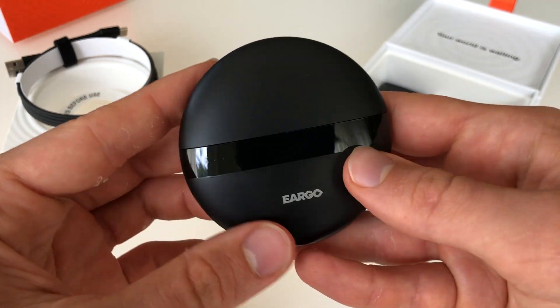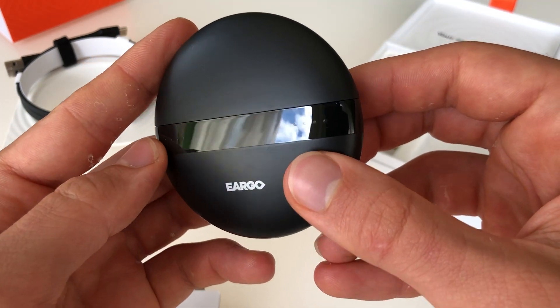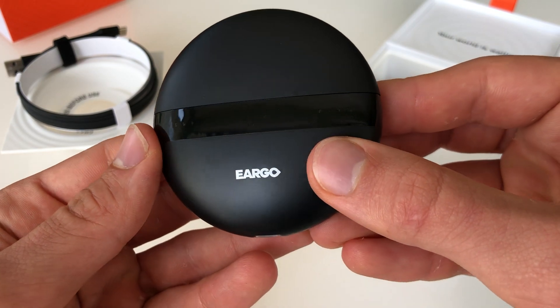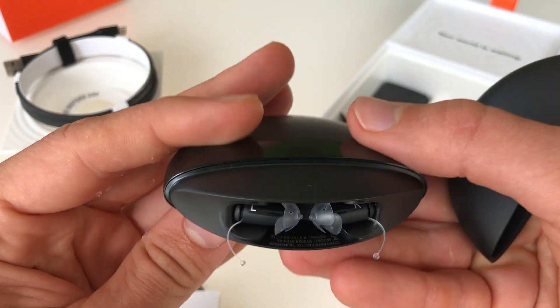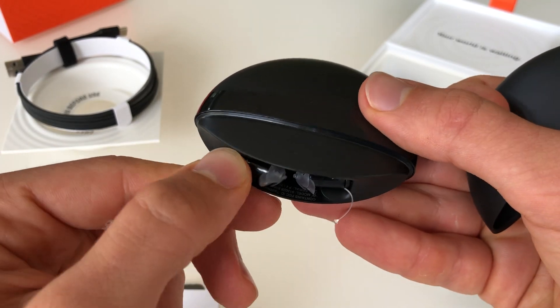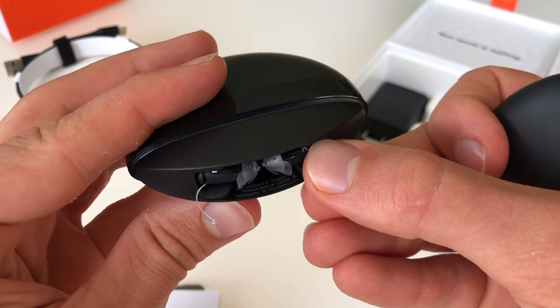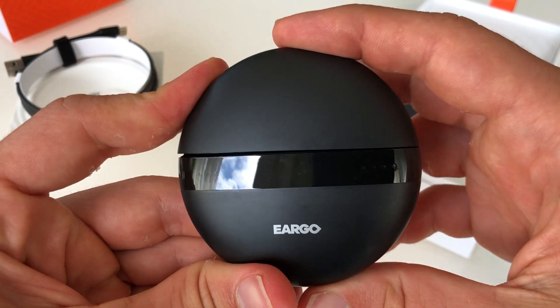Closing the case like that. You can see here there's an electrical line — this has some design on it — and that will show the charging strength of each hearing aid for the left and the right. Up and behind the hearing aid, you can see there's an L for left and an R for right. So that's the recharging case.